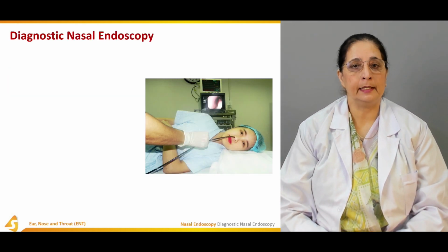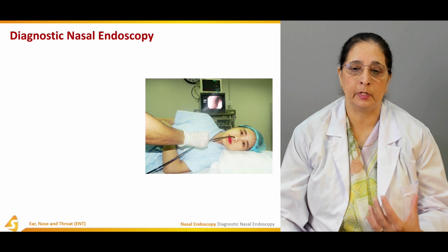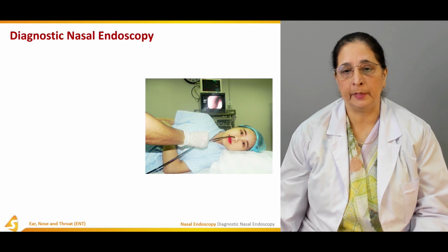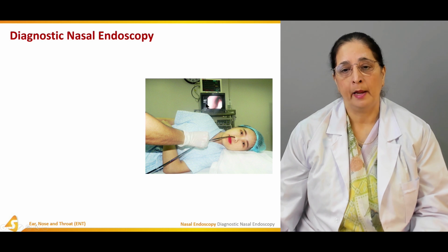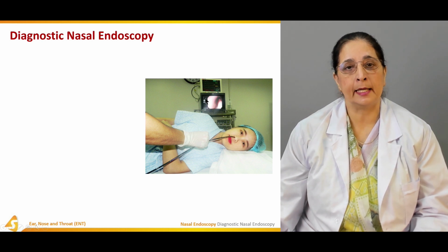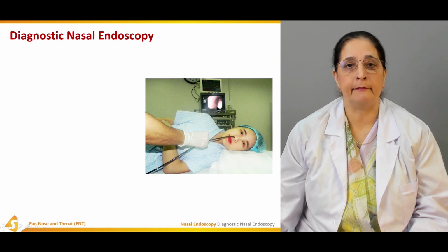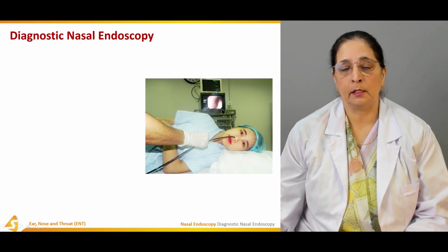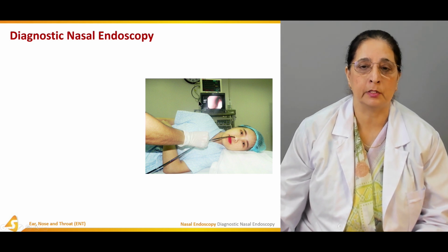So diagnostic nasal endoscopy. Scopy means examination, so examination of the nasal cavity is nasal endoscopy. You can see in this diagram the procedure being performed, and the examiner can examine the patient's nasal cavity and its different parts, almost up to the nasopharynx, on this monitor, where we can directly visualize and observe the different structures.